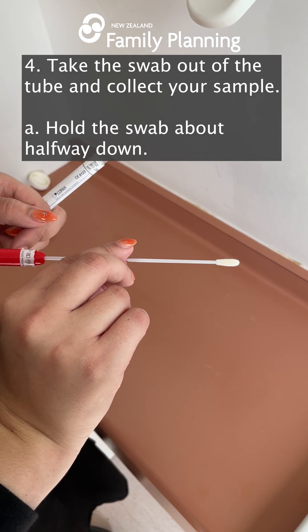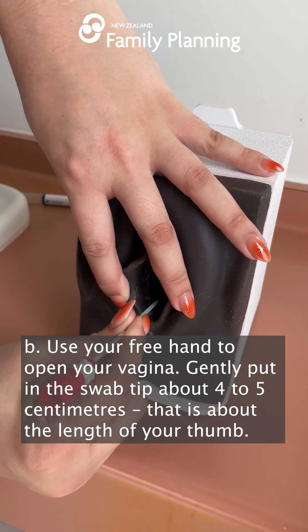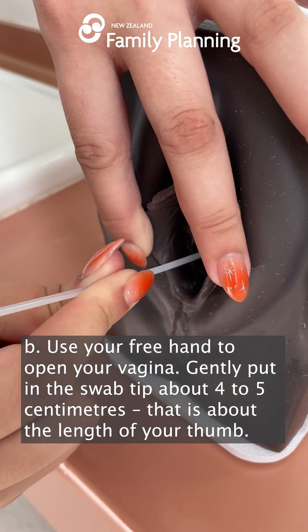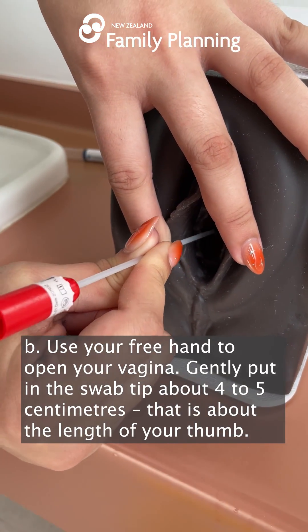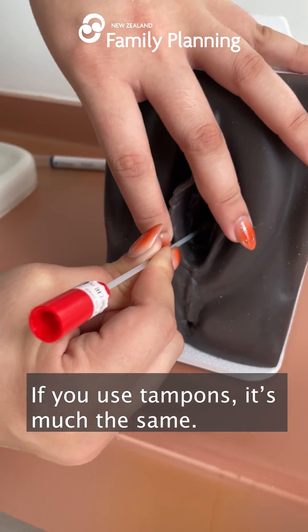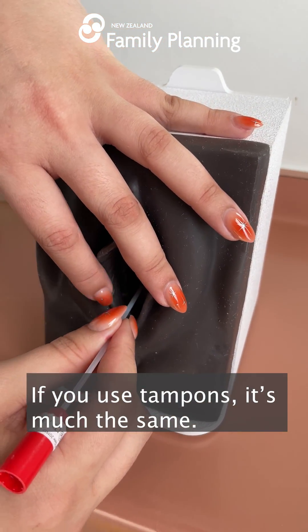Hold the swab about halfway down. Use your free hand to open your vagina. Gently put in the swab tip about 4-5 cm — that is about the length of your thumb. If you use tampons, it's much the same.